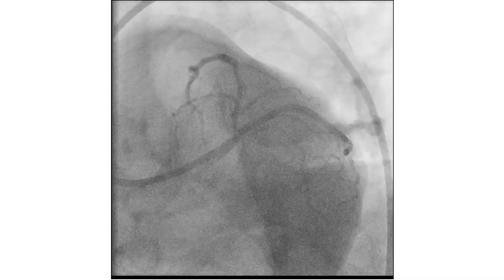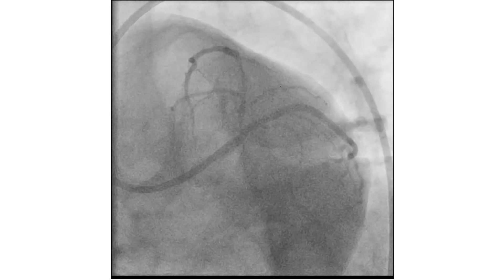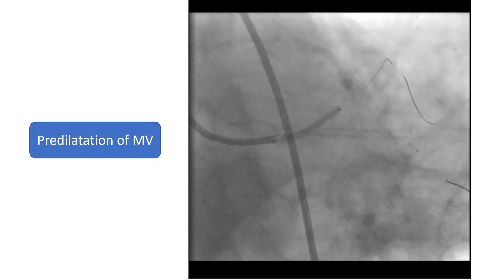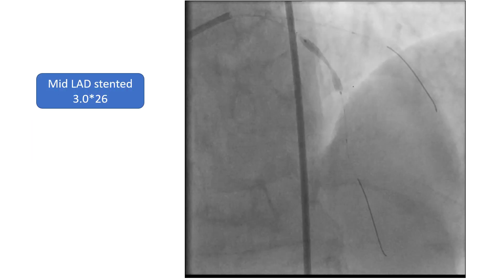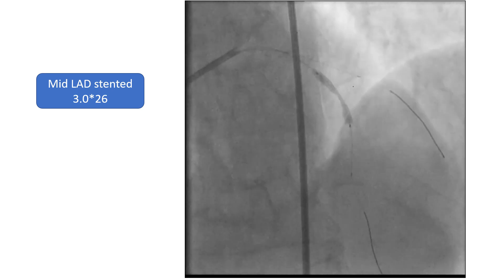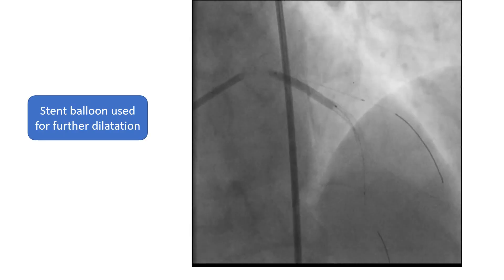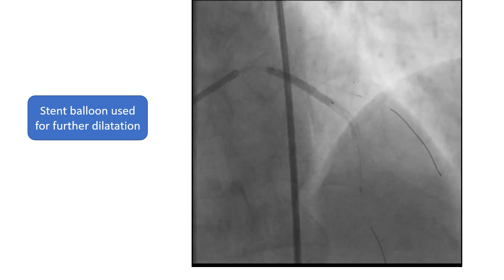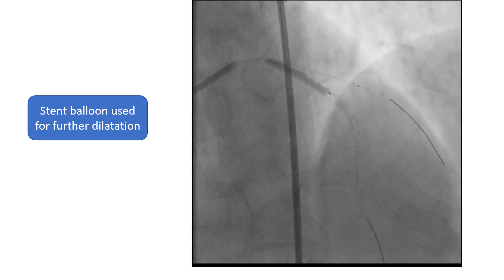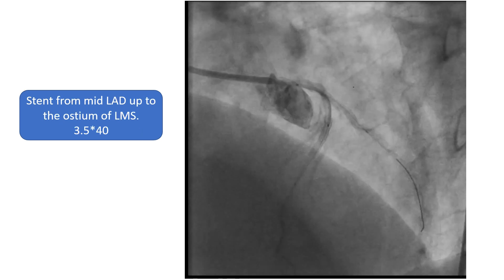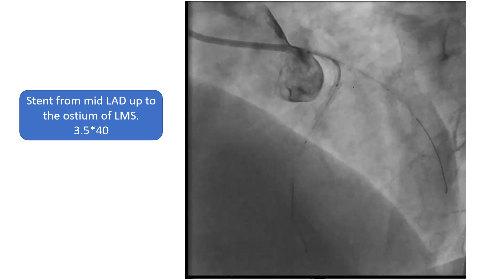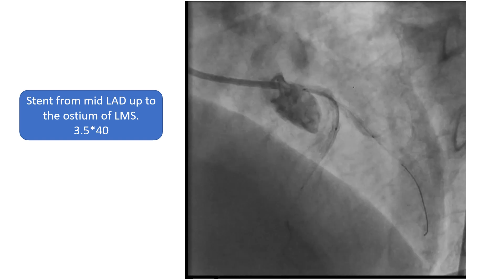This is the spider view, which shows the same findings. Pre-dilatation of the LAD and left main stem was needed. A stent was deployed at the mid-LAD. The stent balloon was pulled back and inflated proximally for further dilatation of the ostium of the LAD. Then a stent was chosen to cover the LAD all the way back to the ostium of the left main stem — it was 3.5 by 40 mm.